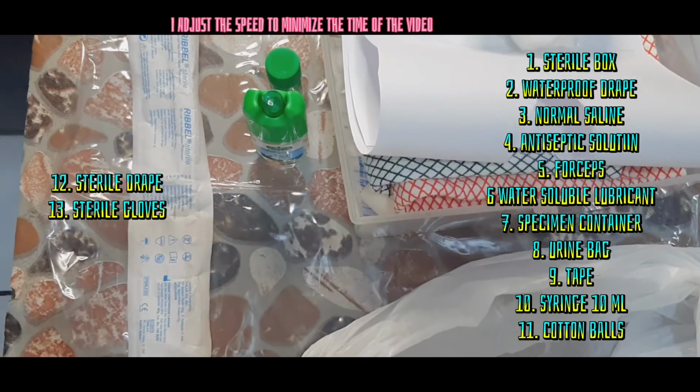The rationale for preparing the materials is to organize them and facilitate easy access during the procedure. Next in assessment, you need to assess the perineal area before catheterization, and assess the urinary meatus for signs of infection or inflammation. Ask the client for any history of latex allergy, difficulty with prior catheterization, anxiety, or urinary strictures. The rationale is that it allows the detection of potential complications. Then assess the client's ability to cooperate with the procedure, in order to determine how the procedure will be carried out.